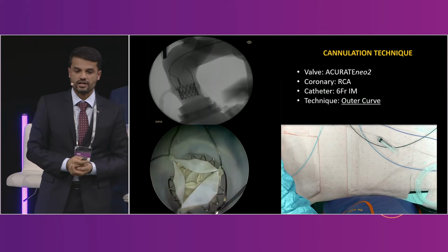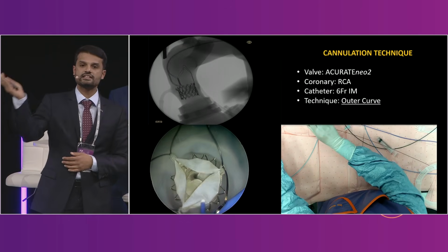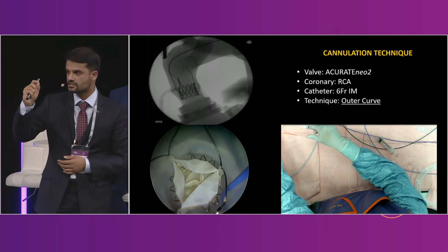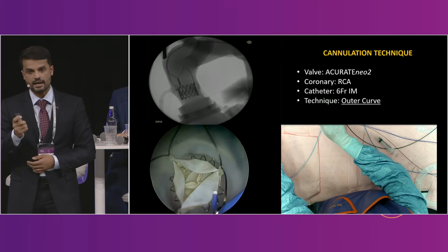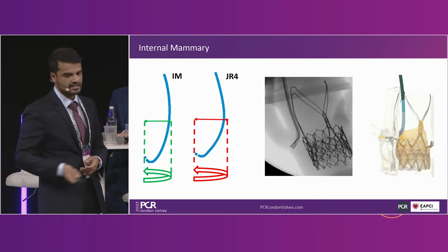Similarly, for the right coronary artery, you can adopt an outer curve technique. So here you're simply directing your catheter along the outer curve. Then you've got the gap, the sinotubular junction, using a short, narrow tip catheter, drop down into the gap and rotate into position. Now, particularly the catheter that's used here is an internal mammary catheter. And I think someone mentioned earlier about using a mammary catheter as an example, exactly.